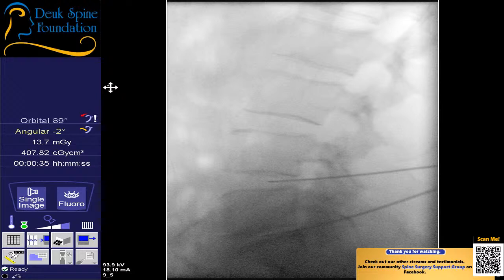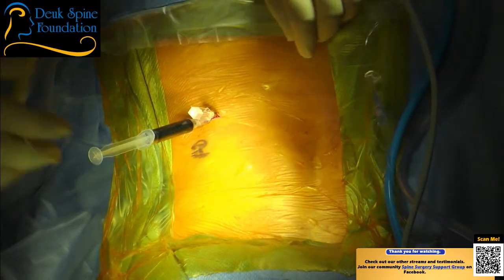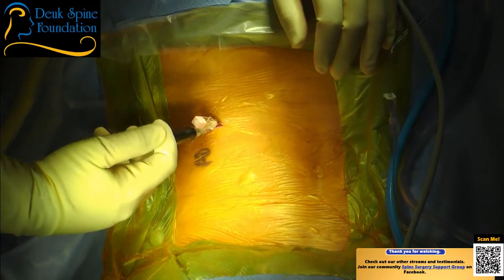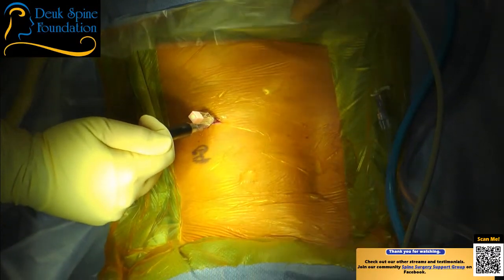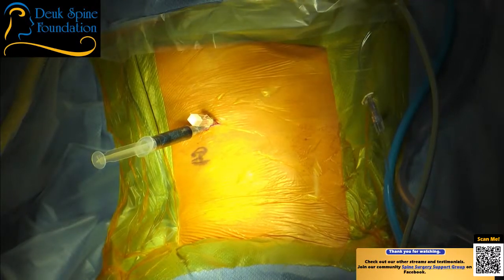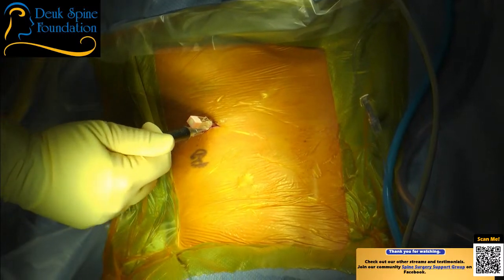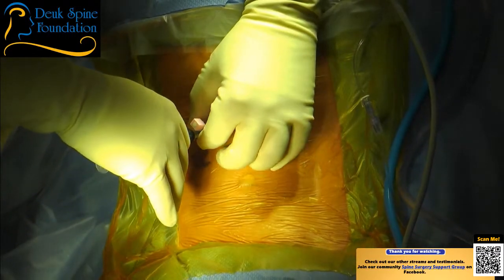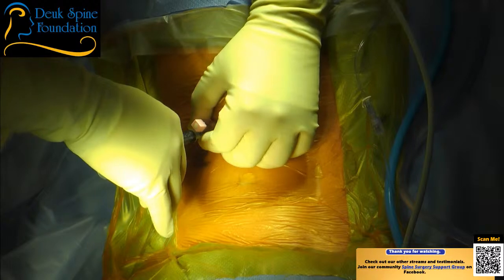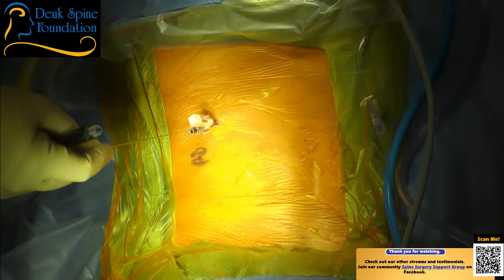Are you awake? So we'll test and then we'll put her to sleep. Are you comfortable? All right. Do you remember where your pain is in your back? Okay. All right. Do you see that, folks? She tensed up and she's moaning and groaning. How bad is that on a scale of 1 to 10? What's the worst it got? 10? Is that where you get your pain? Yes. Okay, so that's concordant at L5-S1, 10 over 10.